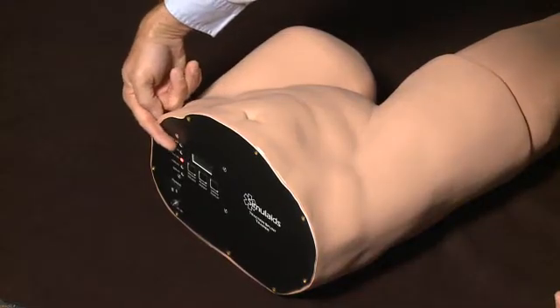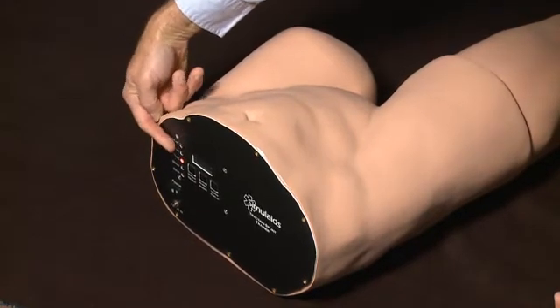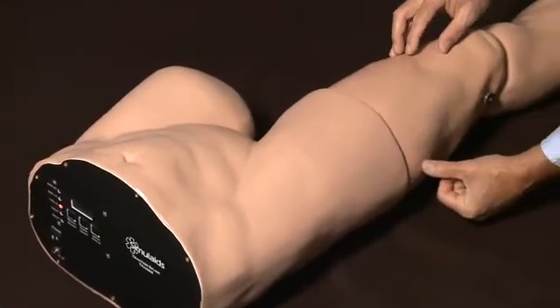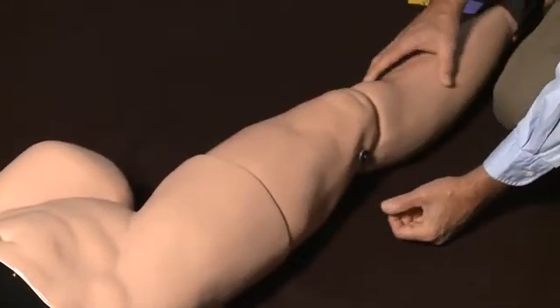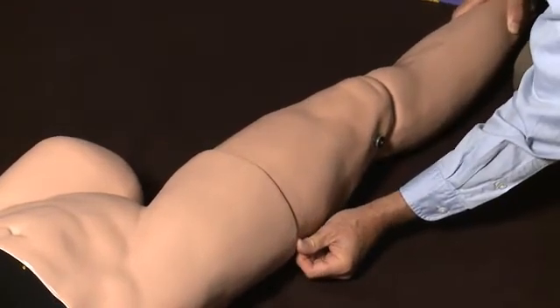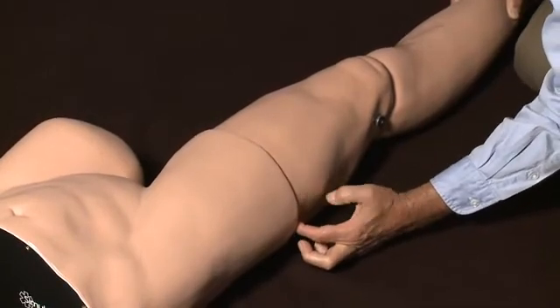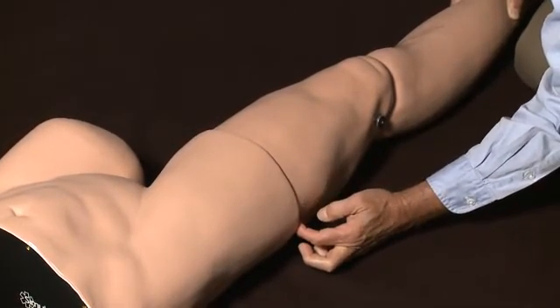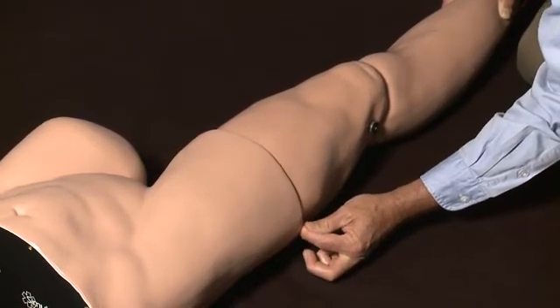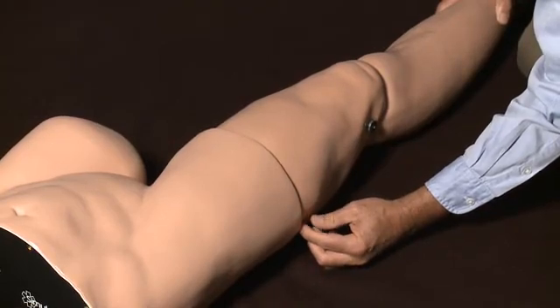Once we have our correct weight setting, we go down the leg, and you'll notice there's a deformity here. As the student applies traction, the leg comes out, pressure is being applied, and the deformity retracts. Depending on where the student has the leg and the traction amount, the audible alarm will sound and the digital meter will read.